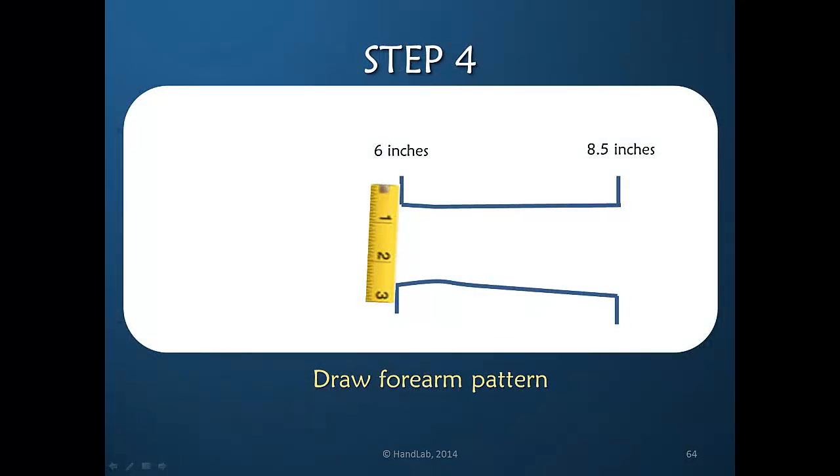The width we need in order to be halfway around the 6-inch diameter of the wrist — that's 3 inches. So we would measure 3 inches and place our marks on the pattern.